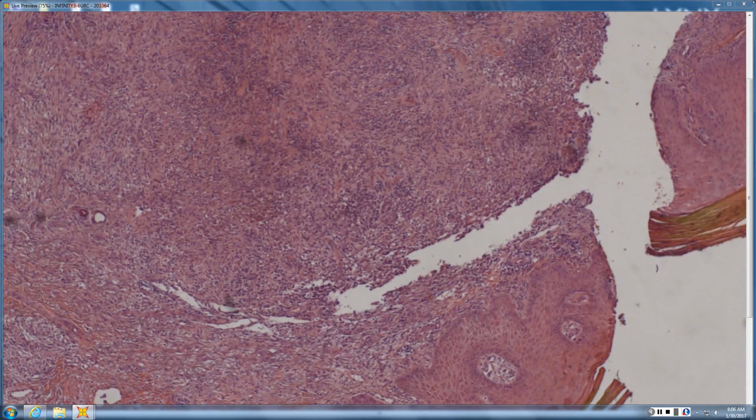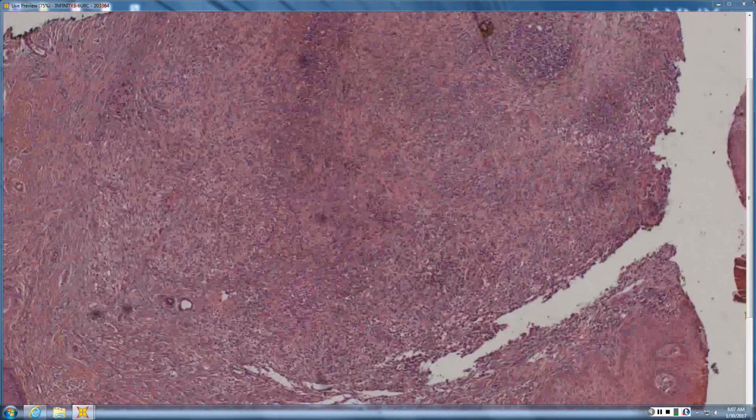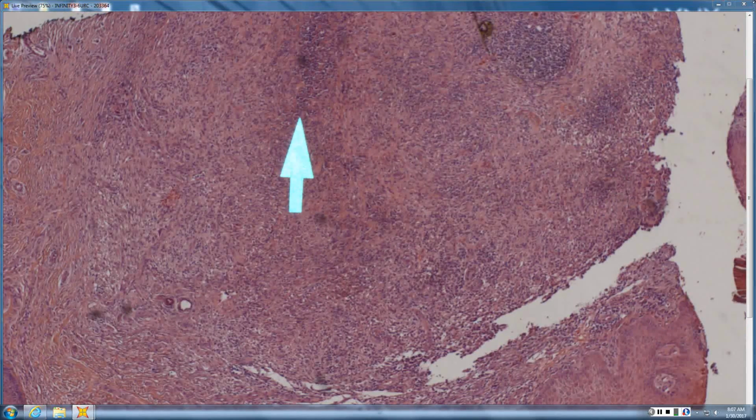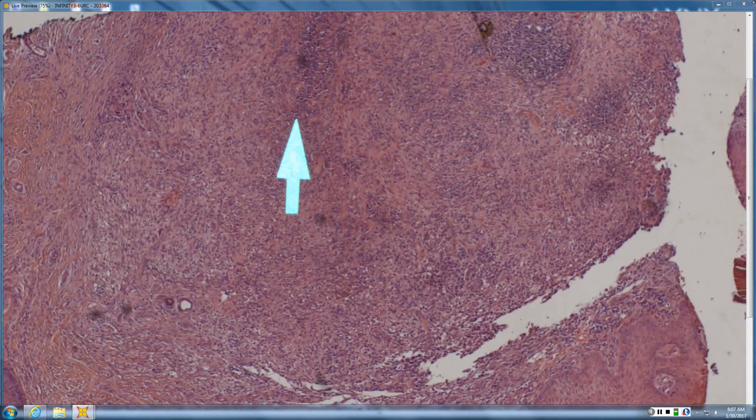So this is a dense and diffuse infiltrate in the dermis. So dense and diffuse almost infiltrate, like a palisading granuloma in the center there. So palisading granuloma with what in the center? Caseous necrosis. Is it caseous necrosis or is it little fragmented black nuclei? Well, it's always the second, so little fragmented black nuclei. So if you have pus within a palisaded granuloma, what's your differential?